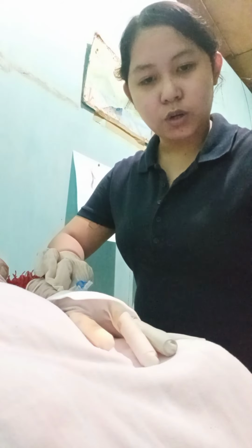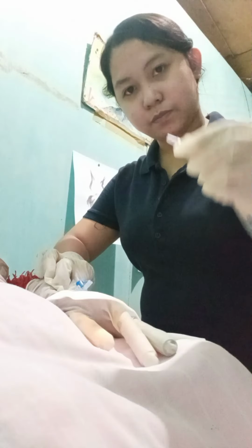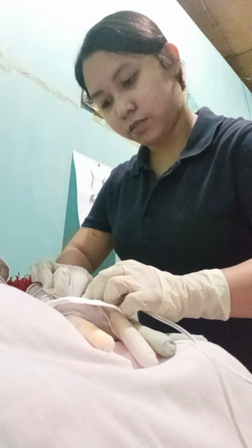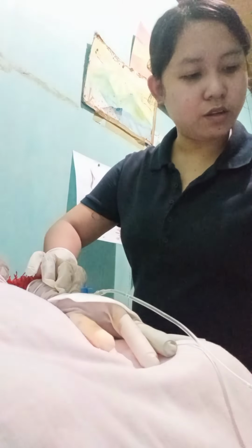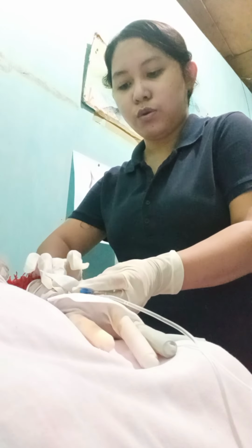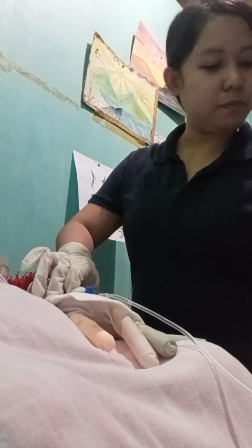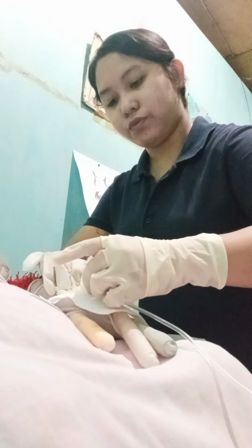Then, connect the infusion tubing. Then, put tape on the catheter to avoid moving, and one on the tubing.